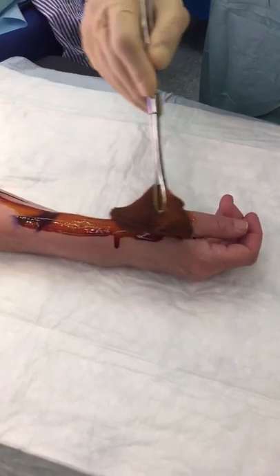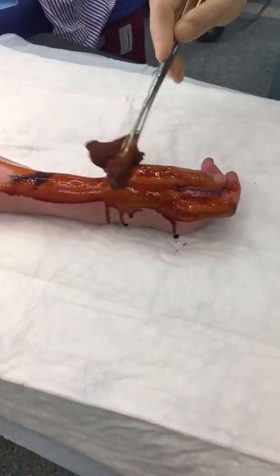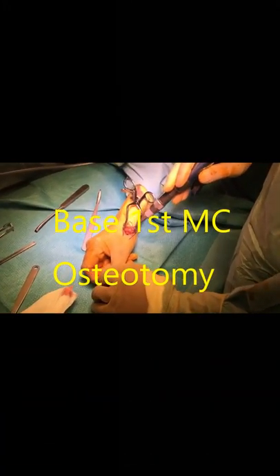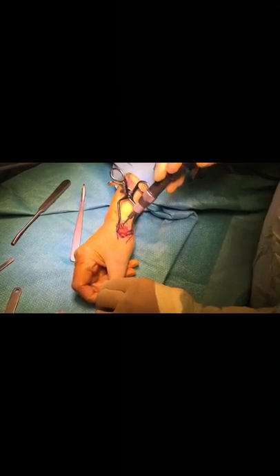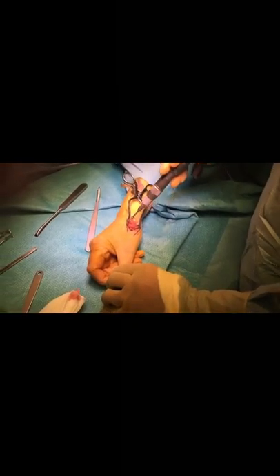The operative side is first prepared with iodine solution and then draped. The incision is made over the first metacarpal and the trapezium. The extensor tendon is retracted and the capsule incised. The base of the first metacarpal is then osteotomized with the saw.